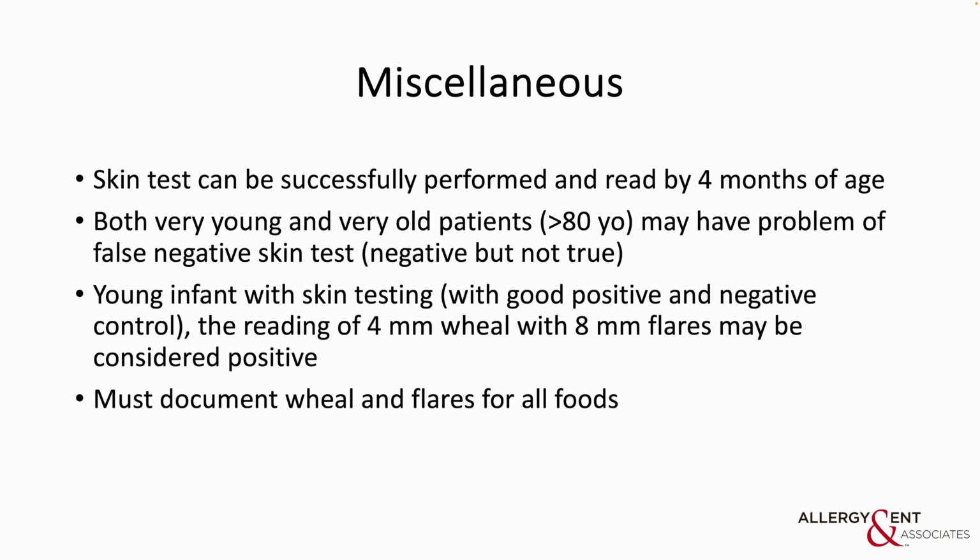So for us as physicians, we have to use the clinical symptoms of the patient to support our skin test findings. Therefore, it is important for the staff to document wheal and flare results for all the food tests. For example, the kid came in, mom says the kid had egg and got hives everywhere. When you put the egg on the skin and you got a 4/8, you say, well, it's not 5/10, so you call it a negative test, you call it a 1, which is true. But to us, that was a positive test, especially on this kid.